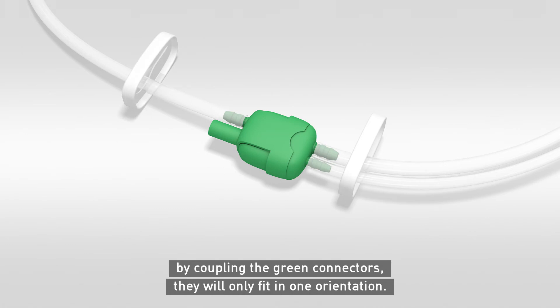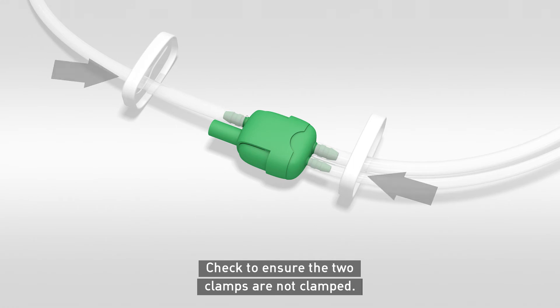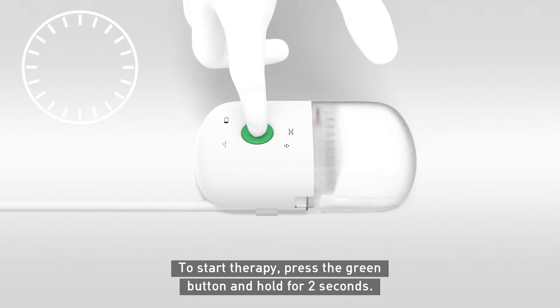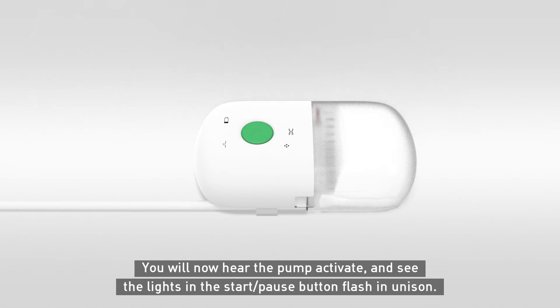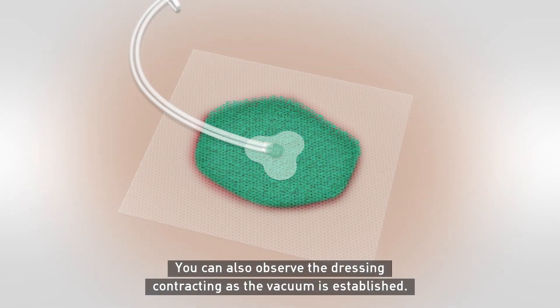Connect the transfer port tubing to the canister tubing by coupling the green connectors — they will only fit in one orientation. Check to ensure the two clamps are not clamped. To start therapy, press the green button and hold for two seconds. You will now hear the pump activate and see the lights in the start-pause button flash in unison.